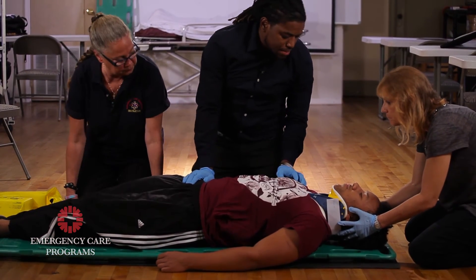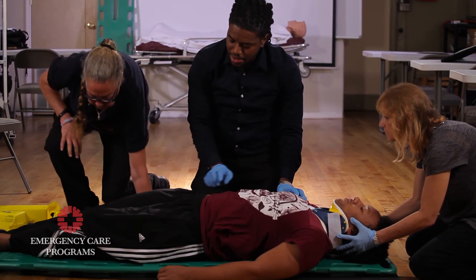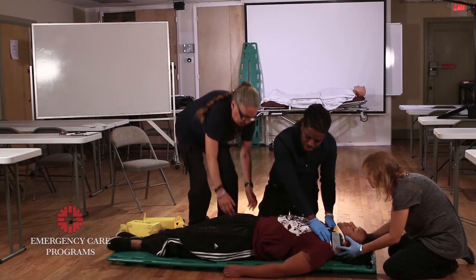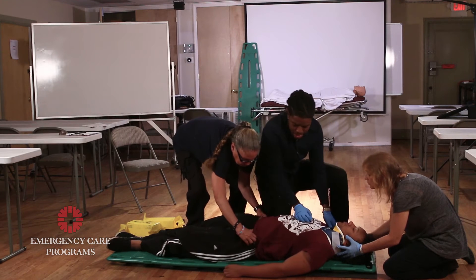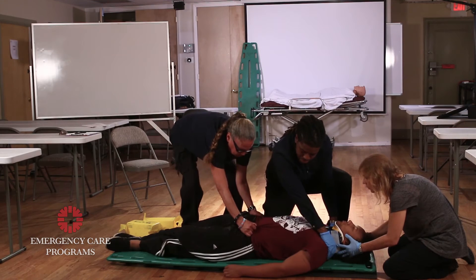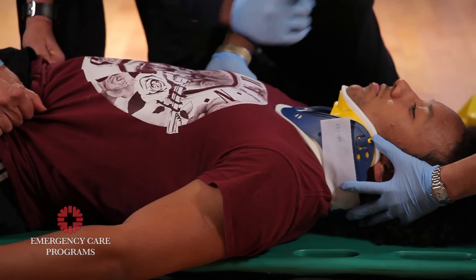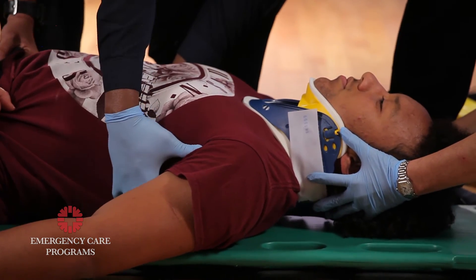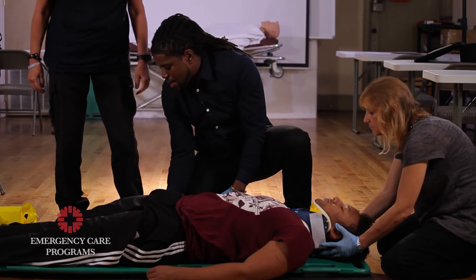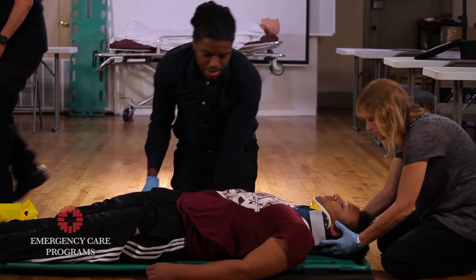He currently doesn't seem to be centered, so we're going to slide him down and then up in a V-shape. Can you grab his hips? I'll grab his shoulders. We're going to go down at an angle — on the head person's count. One, two, three. And slide him upward in that direction. Ready? One, two, three. He now appears to be centered on the board.